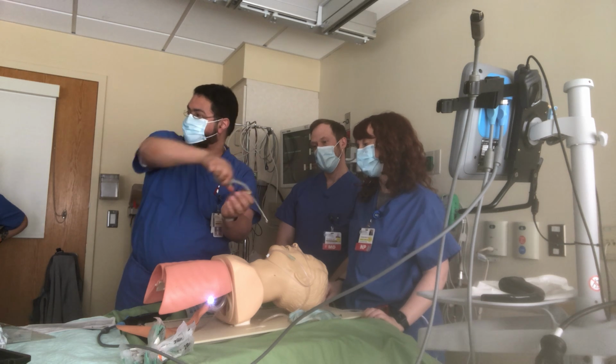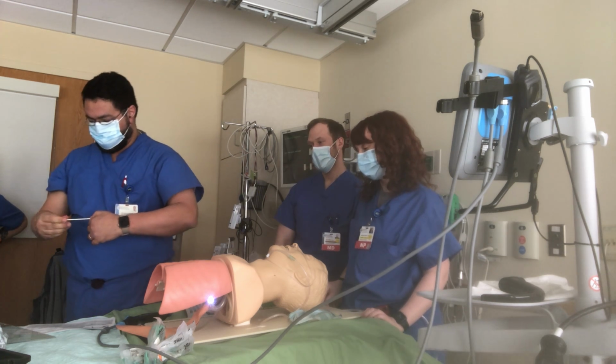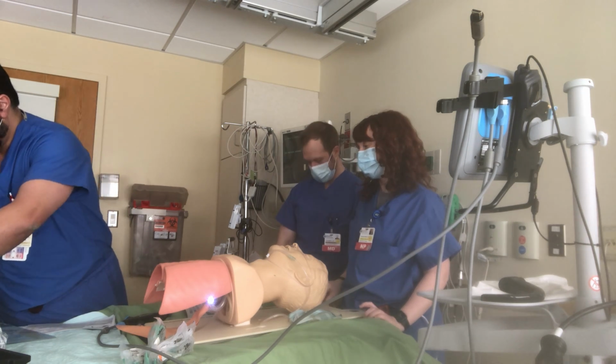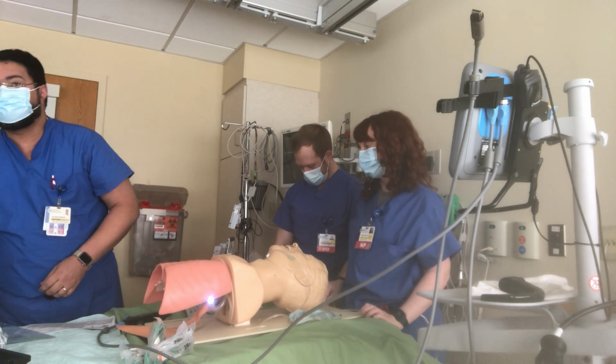Like I actually spray at the larynx, and the epiglottis and stuff like this. All right, so we put those here. And then what's next? Lidocaine ointment.